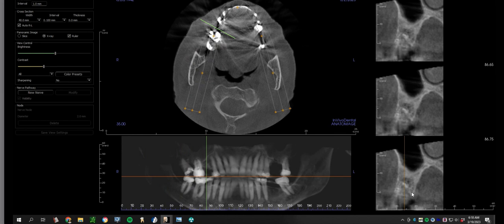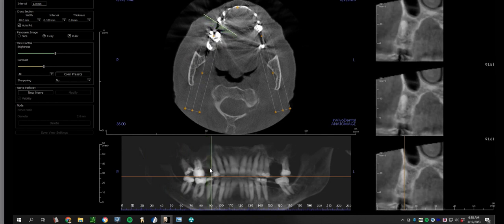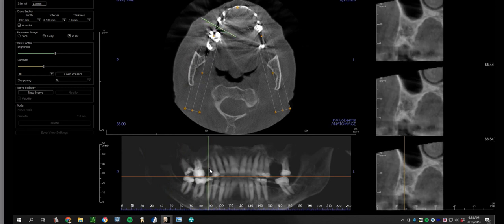Let me reframe that. If this patient had this tooth removed greater than a year ago, then I would bring some attention to this area. Again, she's not on bisphosphonates. Fortunately, if she was, I would probably send her right to the oral surgeon and send them this image and your concerns. With that said, I'm just going to assume that this is probably a recent extraction site that is in the process of ossifying. I'm looking at the alveolar ridge here, and that just looks rather irregular with some opacification. It again looks funny.